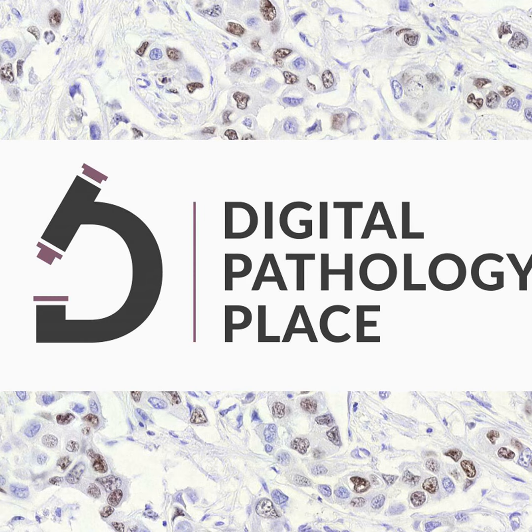So in the end, what HistoQC does is you can provide it with whole slide images, and it will identify where on the slide there are artifacts, like cracks, like pen markings, like tissue folding, regions that are too dark, regions that are too light. It'll identify those and mask all of those out for you and give you a binary mask that says these are the good regions for computation. At the same time, it will go and produce metrics that measure the properties of that slide. For example, how bright the image is, or how bright the tissue is. So we'll go and extract all of the background and all of that stuff. And when we have finished doing all of the artifact detection, that mask that's left is just tissue.